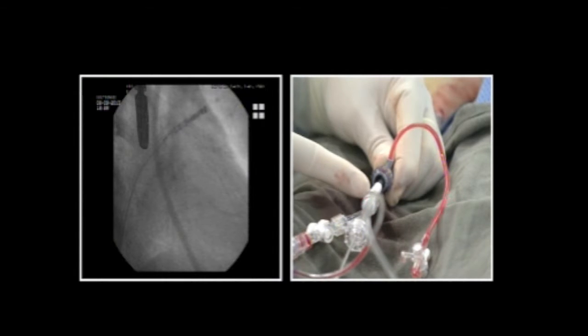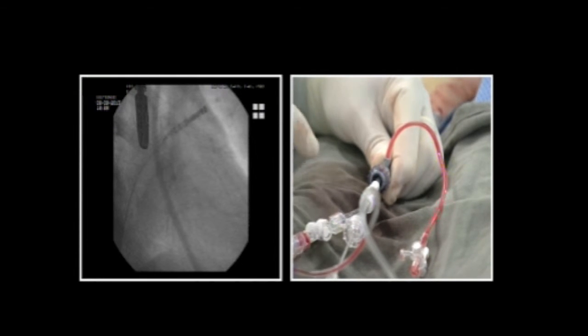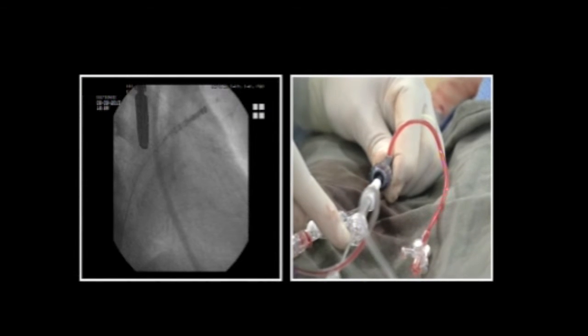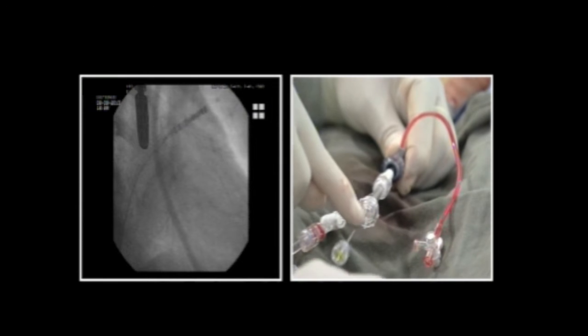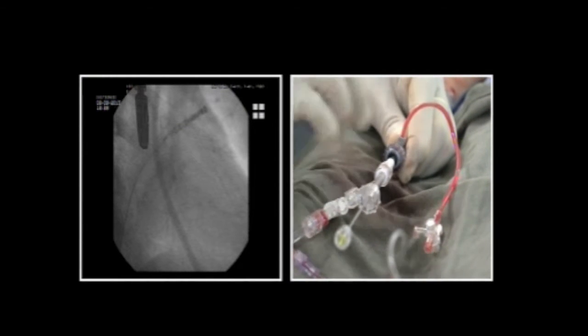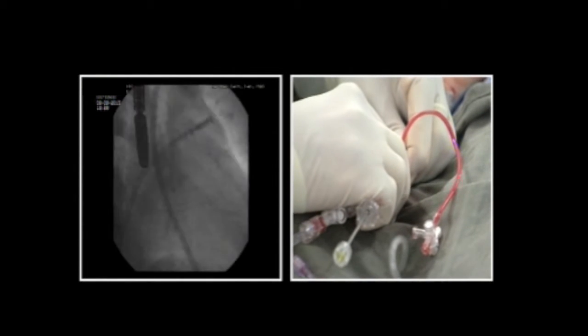Okay, so the delivery catheter is inside of the sheath, there's a little rim here. When I bring this together, the delivery catheter and the sheath will form one single unit, and then I have still this metal part here which is connected to the device, and I will keep the device in place and pull the assembly of delivery catheter and sheath together back in order to expose the device. Okay.